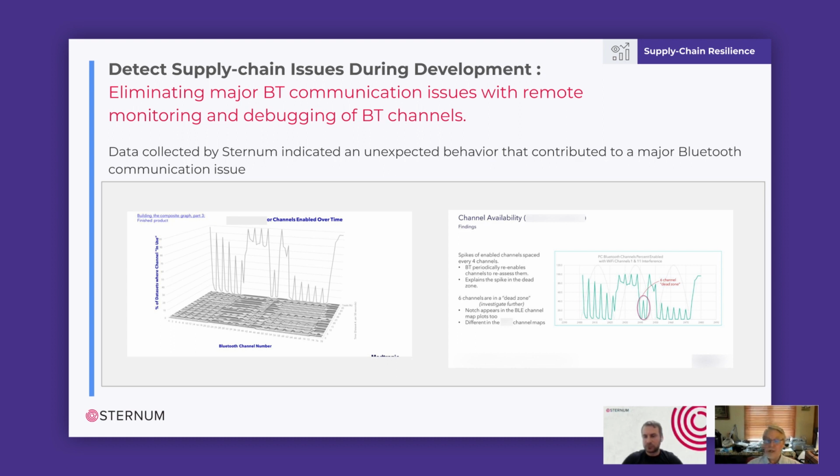Yeah, actually we do, and I was quite surprised by that too. We have one piece of equipment that we call a base and one piece of equipment that we call a patient connector, and they both use Bluetooth to an iPad. But one thing that's different about the patient connector is that it's often used for conducting telemetry, as we call it, over low energy Bluetooth to an implant.